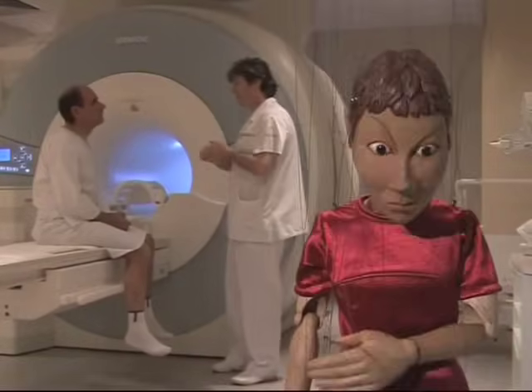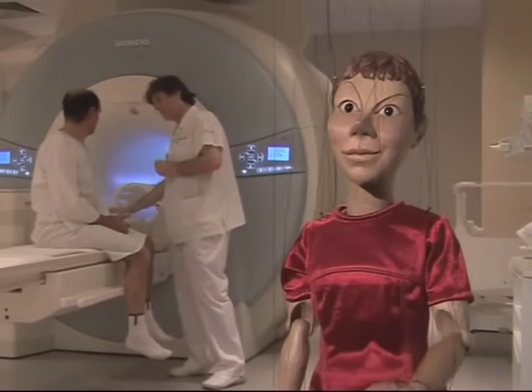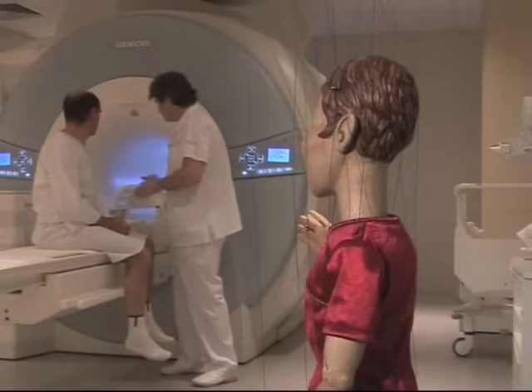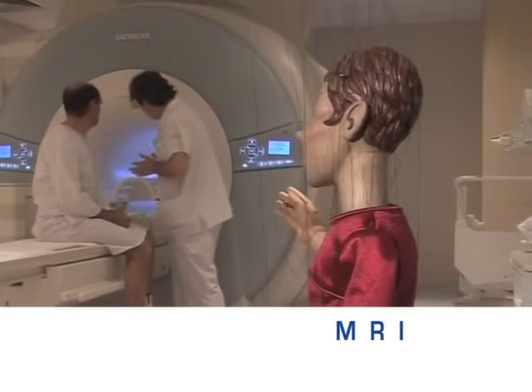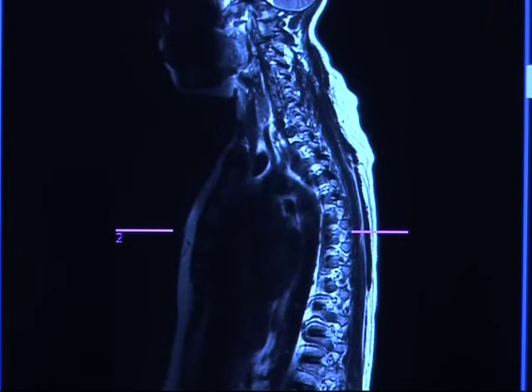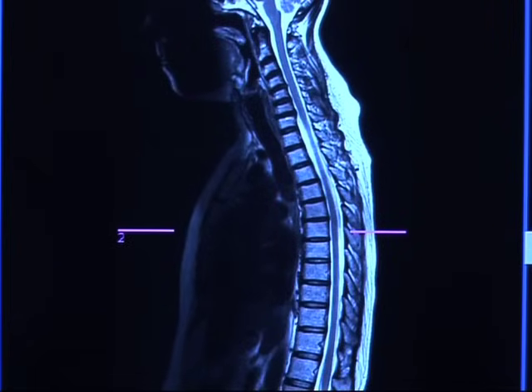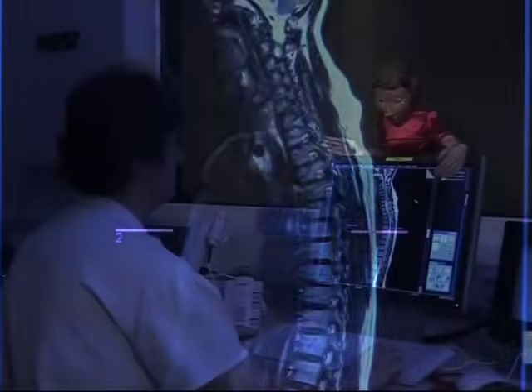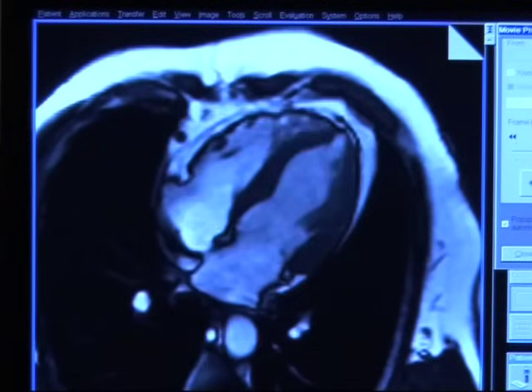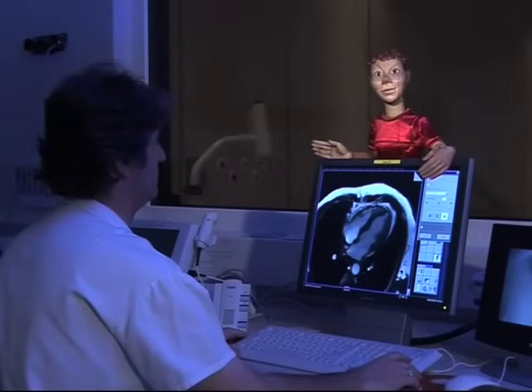Hi there, my name is Paprika. I am delighted to explain the MRI exam procedure. This is a magnetic resonance imaging scanner, but let's just call it an MRI. We can observe almost every part of the body from head to foot and from every angle with this imaging device, particularly the internal organs. And if we have a clear idea of what we are looking for, we can attain great results.